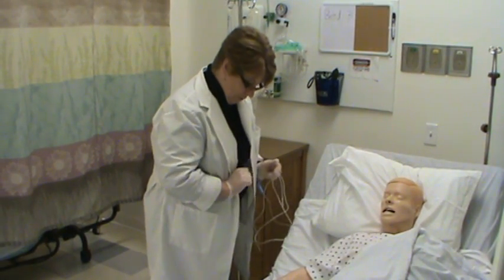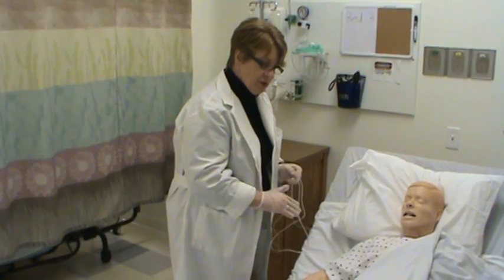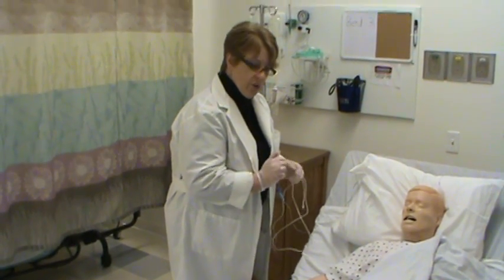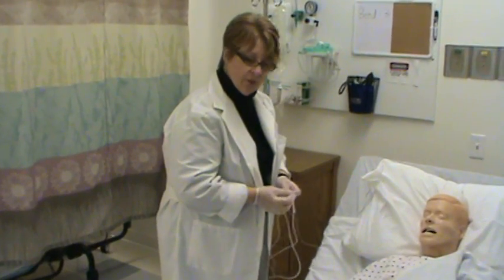And then you've already demonstrated in the med room that you know how to set the rate. So at this point you would do your end of the return demo type things. You'd leave the call light in reach, you'd leave the bed in the low position, you'd leave his belongings in reach, you'd discard your gloves, you'd do your hand hygiene, whatever else you need to do.